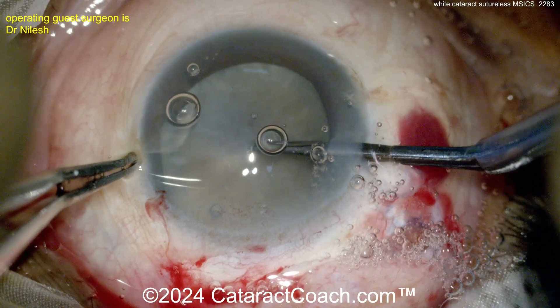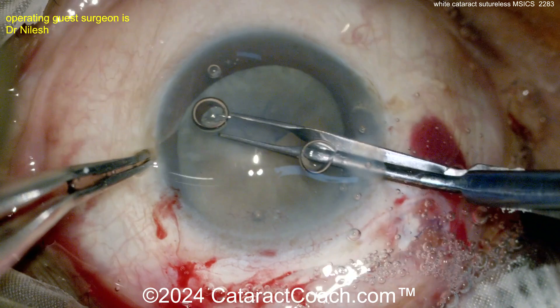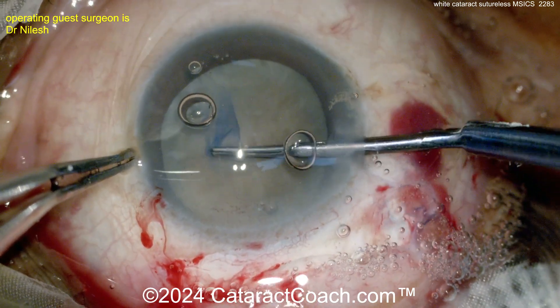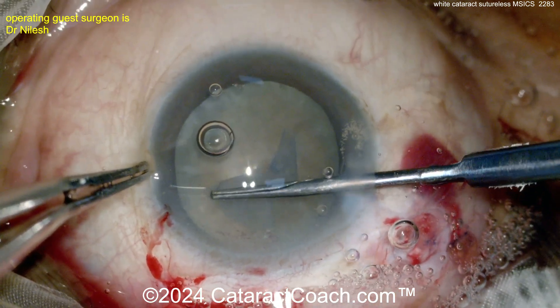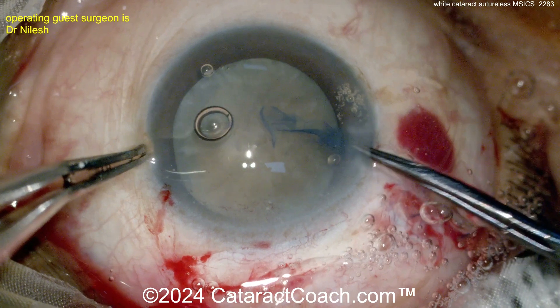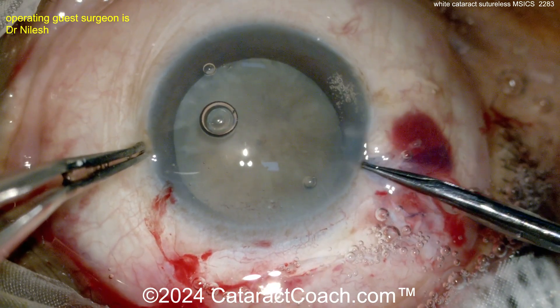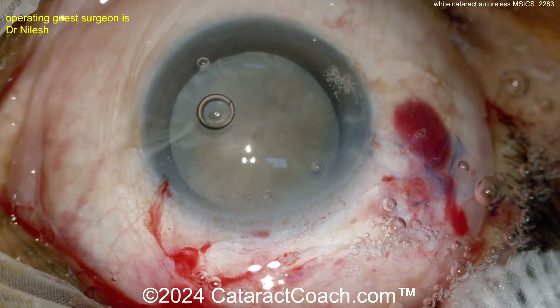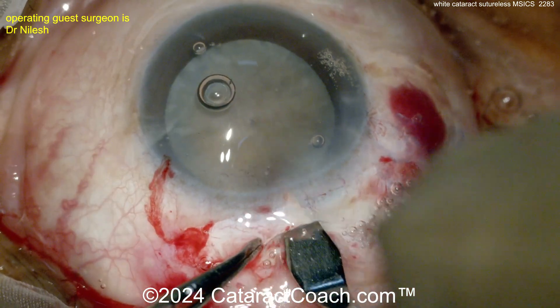Now let's get the capsulorhexis done using micro forceps through the side port. Remember to make a generous capsulorhexis — you don't want a small one here because you need to let the whole nucleus up out of the bag. You want at least a five millimeter rhexis, even up to six. Ideal is probably about five and a half, but just don't make a small one.